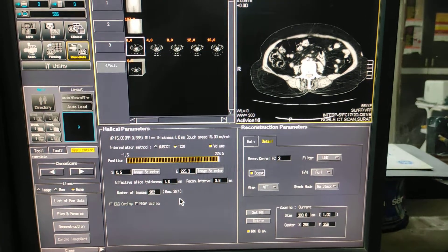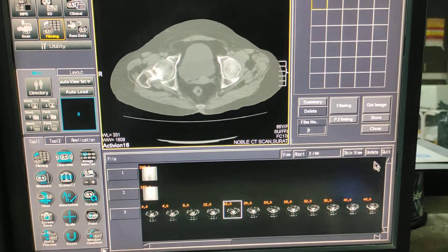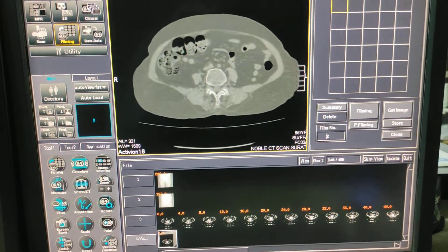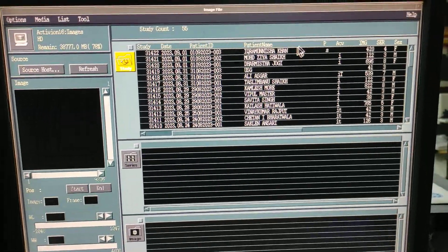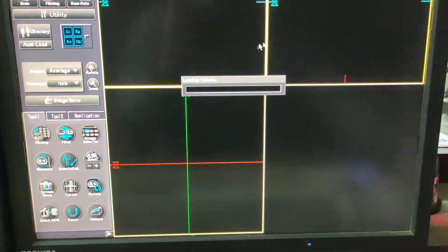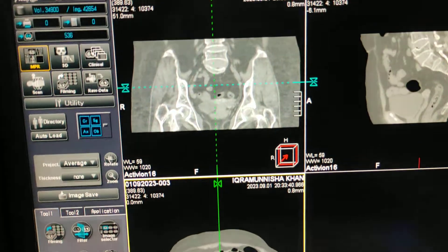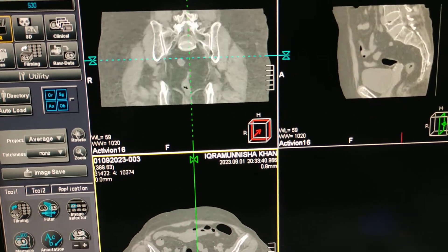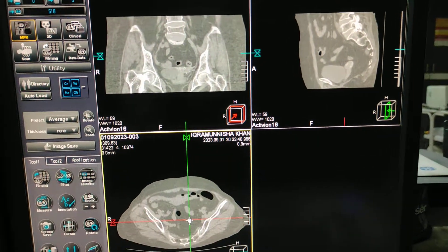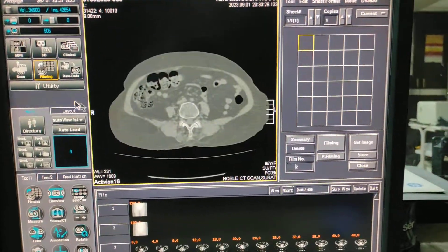This is how you get proper reconstructions for the bony window as well as 3D images. After getting the recons, click on the image, then click on the HD disk. Click on MPR to view the images. Here you will get proper images for pelvis with both hip joints. Then enter the films section and print. The 3D reconstruction is still ongoing so it will take some time.